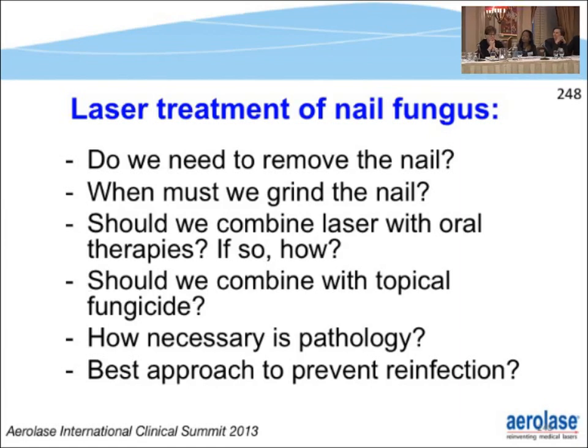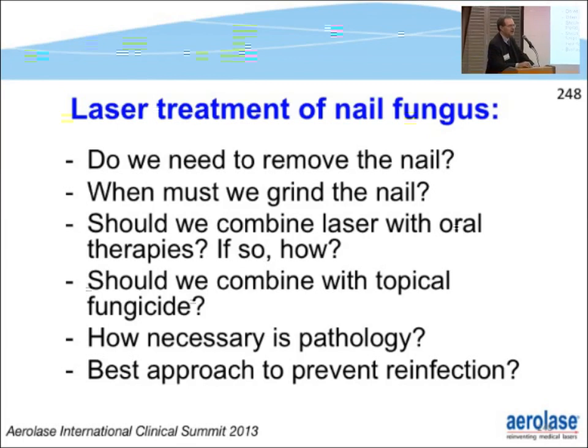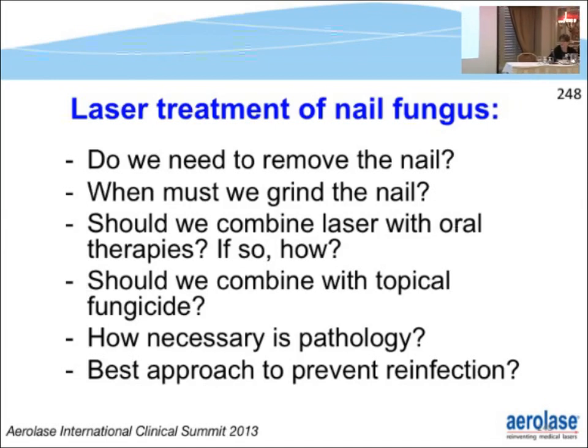When must we grind the nail? When it seems a little thick. I found the penetration of the Nd:YAG lasers is pretty good. So once in a while, you'll run a test spot on it, and you'll see the thing sparking. If it sparks, I would say at that point, you need to grind it down a bit. Usually, if there's some debris, it'll spark. If somebody has polish on and they didn't get it all off, you missed it, it'll spark. You can toast marshmallows at that point.